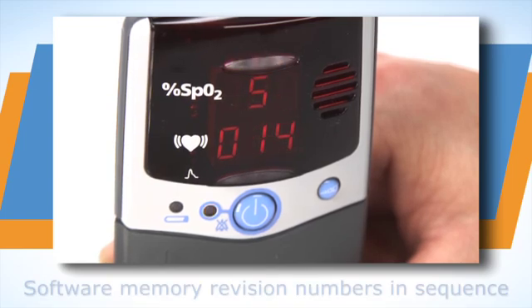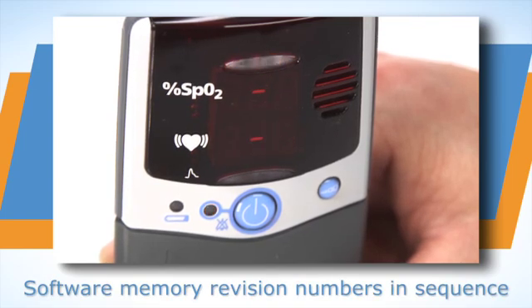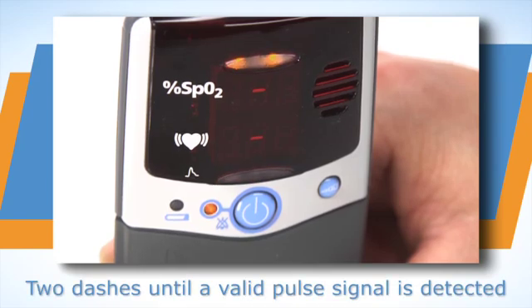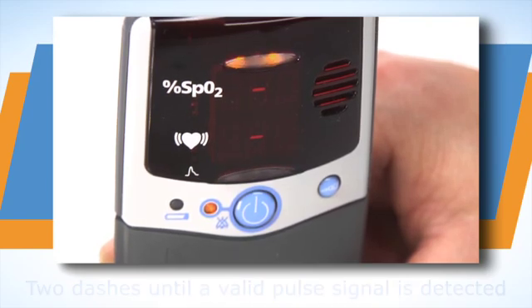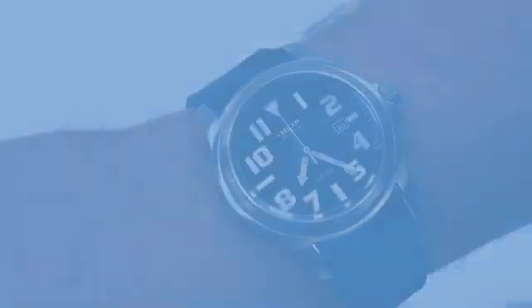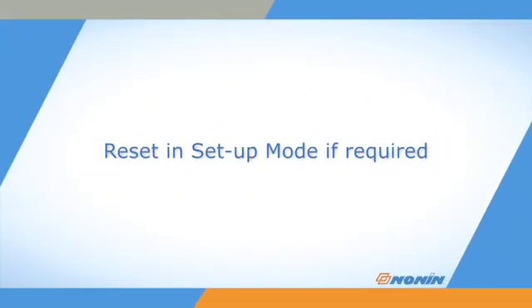If any LED elements do not appear, or if any of the displays do not appear as expected, remove the unit from use and return it for service or repair. Check the oximeter's time and date settings for accuracy during startup, and reset the oximeter in setup mode if they are not accurate or appear as zeros.